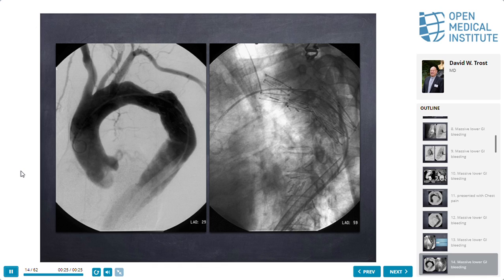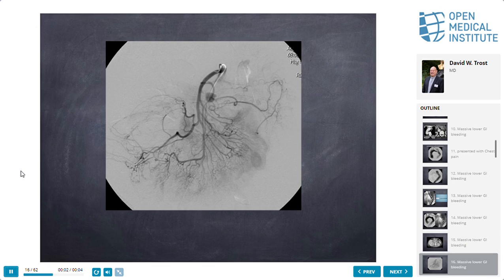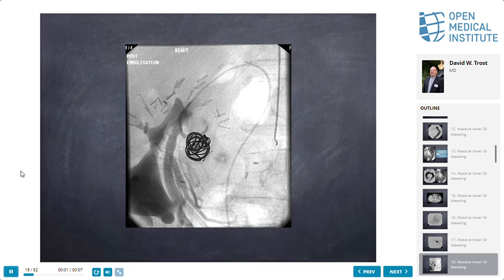Okay. This is a post-op patient. I don't know what was post-op from, but there's another real extra bright spot in there that isn't supposed to be there. And there's this pseudoaneurysm coming off a branch of the superior mesenteric artery, catheterization of that branch, and filling of the aneurysm with coils to get rid of that.